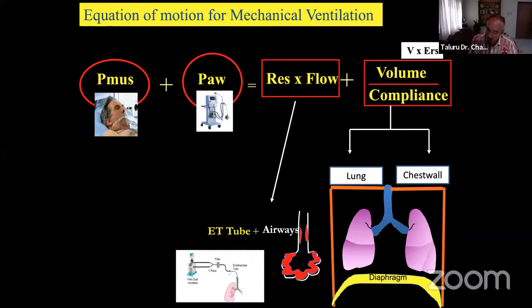So what I want to underscore here is the whole understanding of a postgraduate should be, once you anesthetize a patient and once you see a PIP and a plateau before you start with the incision, then any alteration, you have to see whether the transairway pressure is more or the plateau pressure is more. If the plateau pressure is more, there can be two components. One is lung or chest wall. Whenever it is of the chest wall, you can be more aggressive with the PEEP and recruitment maneuvers. If it is the lung, probably a primary medical correction may be required.